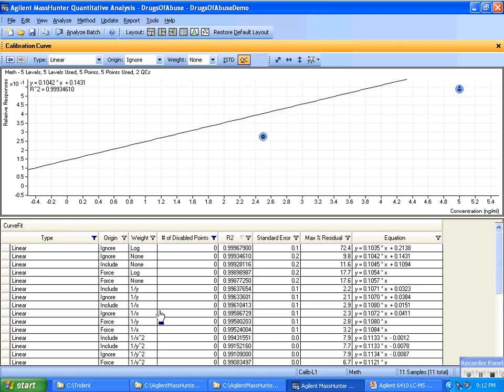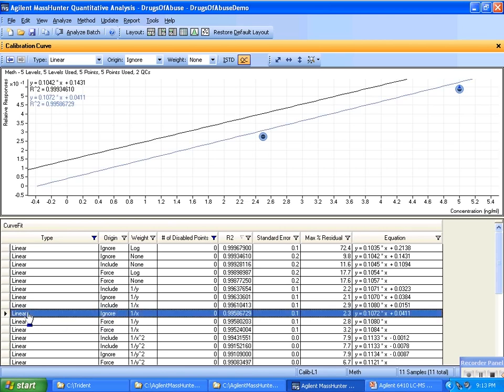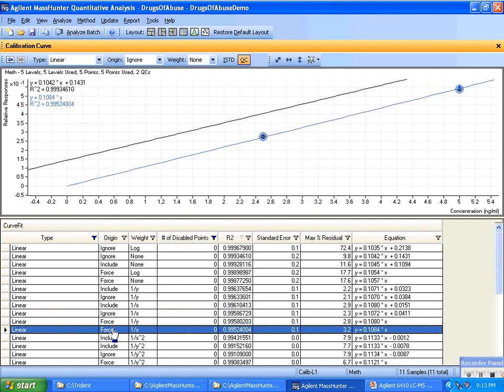So if I go down the list a little bit further, if I go to linear ignore and 1 over x, you'll see a blue line appears here, which is a much better fit. And let me try to force it with 1 over x. Now the line appears right on top of those points. That's a good fit. So here was my original curve, and here's my proposed curve.